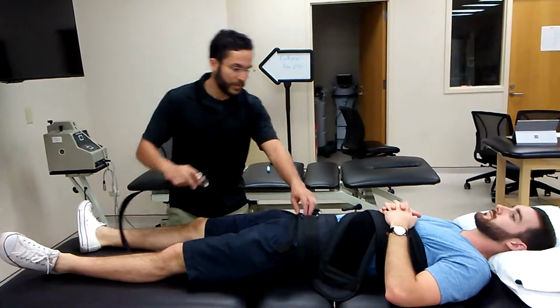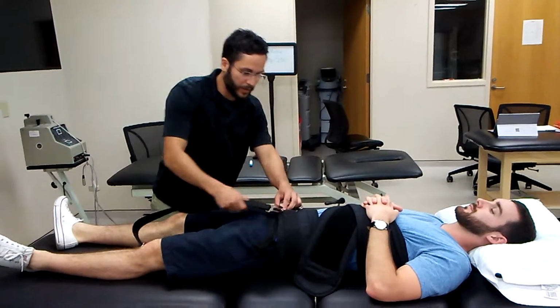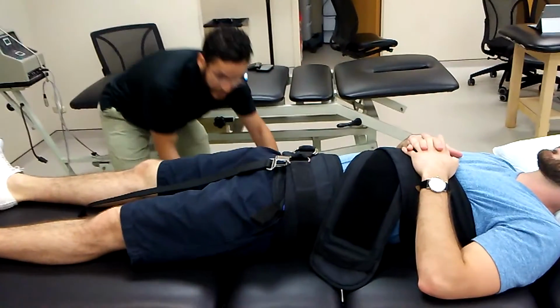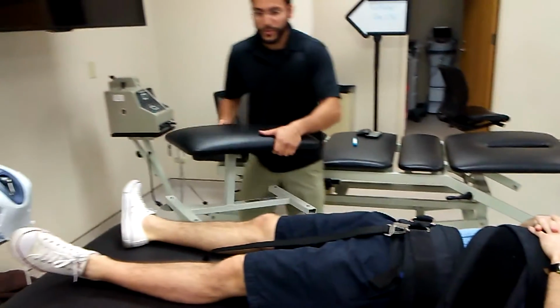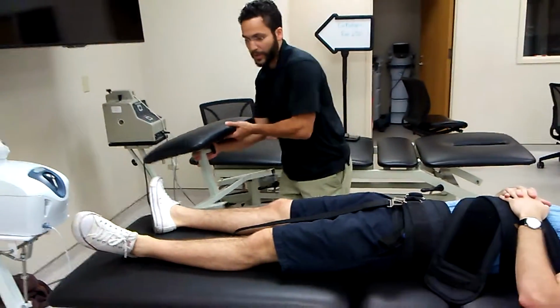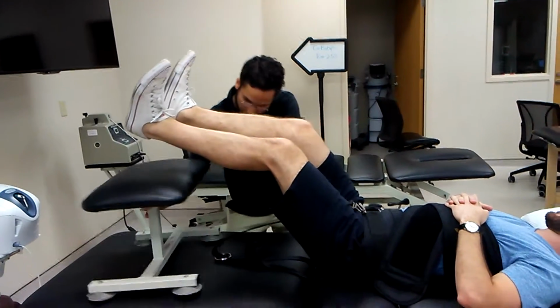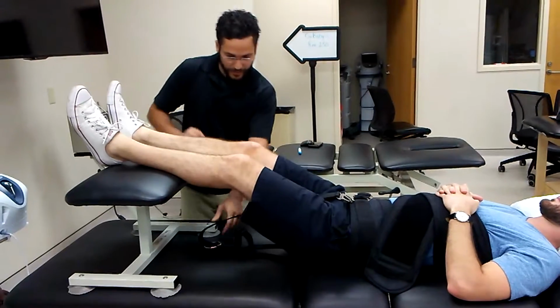What to do is we're going to clip this on the metal ring, and since this is muscle spasms of the posterior back, we're going to prop his legs up. And it should be flexed.